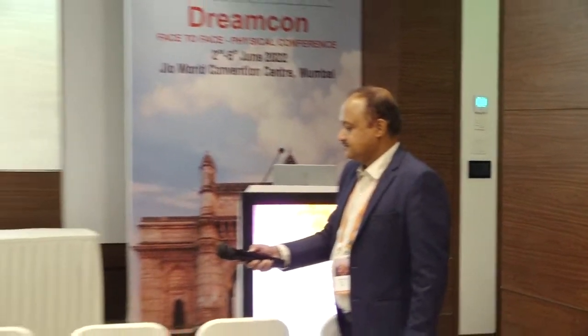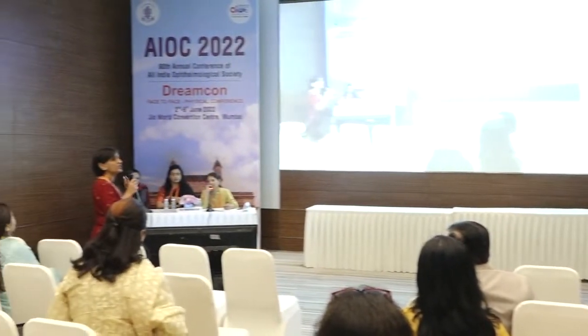She just answered that. Actually, this is used as a screening tool, so you can always do gonioscopy and confirm. You do photopic and scotopic, see how the iris is behaving, and after that you can give knowledge to the patient. The patient understands what his anatomical position of the eye is, and whenever there are symptoms, you make them aware of the symptoms. We are basically making the patient more aware.